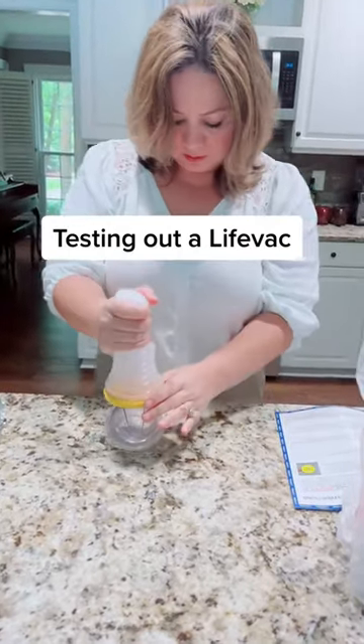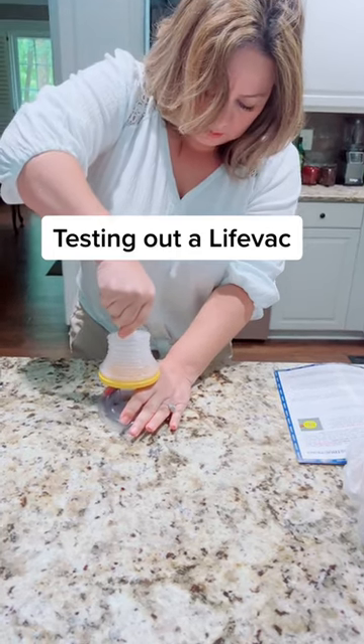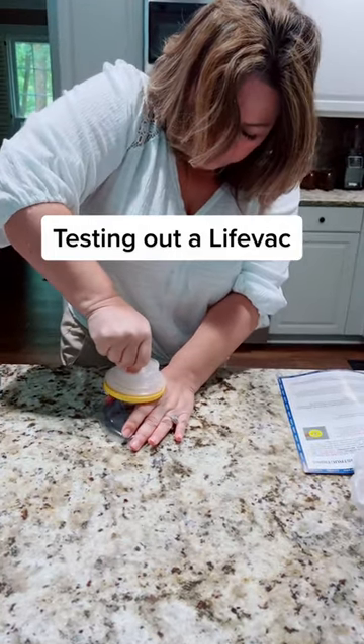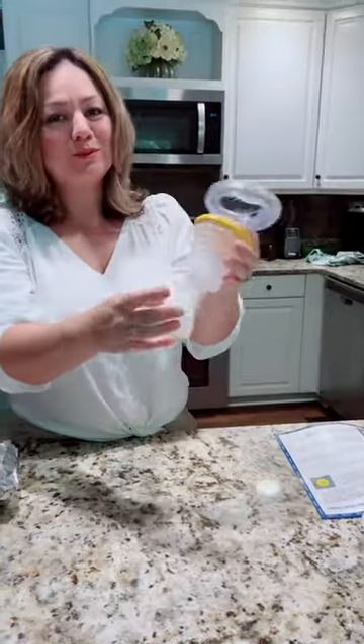It doesn't have to be inserted all the way in. Flat surface, hold the mask down, and then push it, and then we're gonna pull quickly holding the mask. Yeah, that's tight. I'm not supposed to do this right?